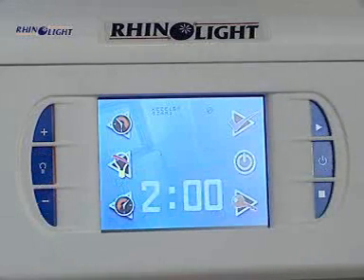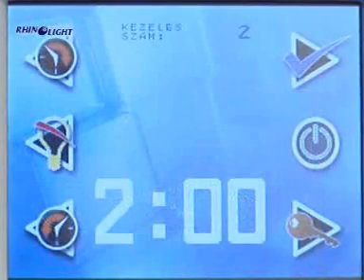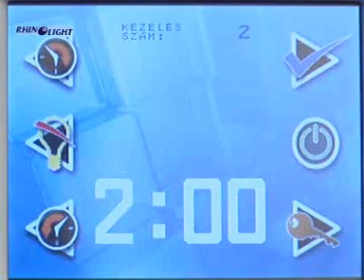Then the source of light can be switched on. After turning the source of light on, wait 30 seconds for the light bulb to reach operational temperature. As soon as the waiting period is over, the equipment is ready for the treatment.